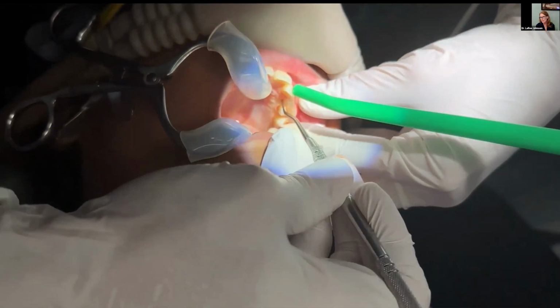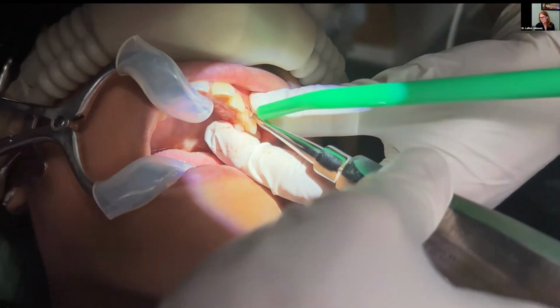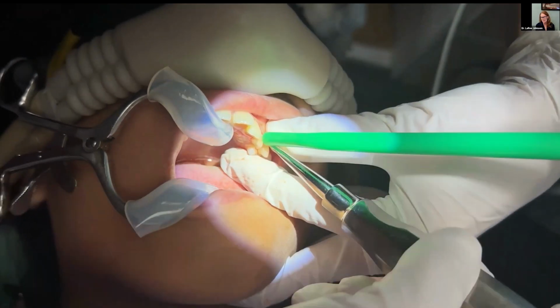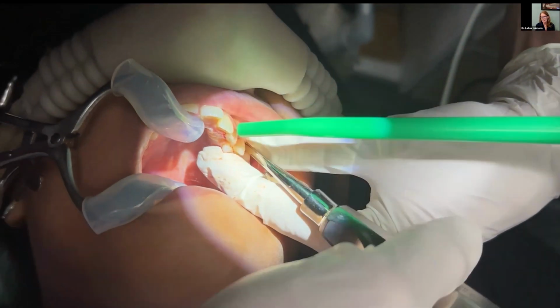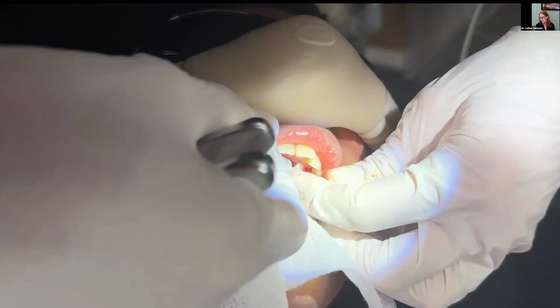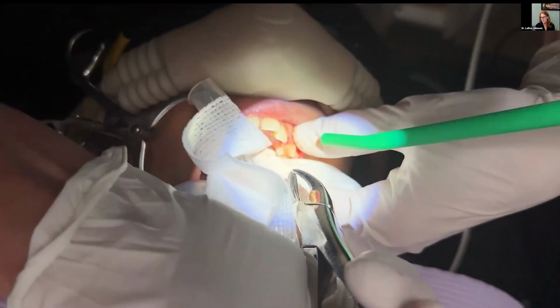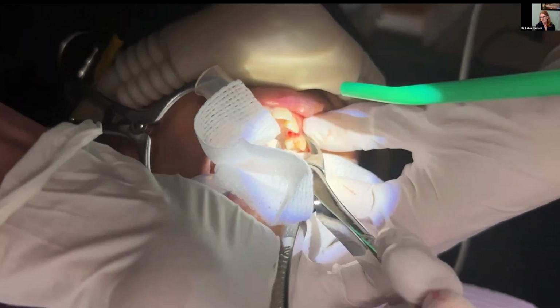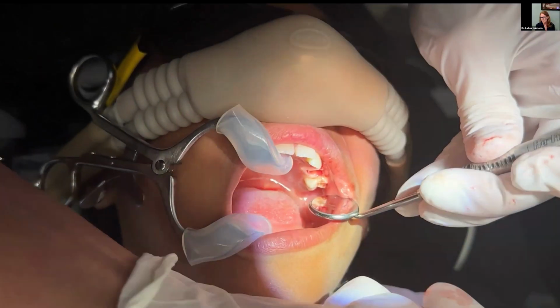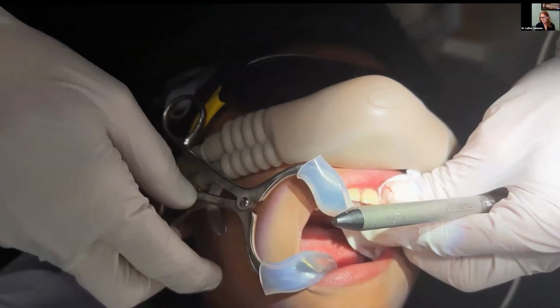I usually don't use elevators on primary teeth unless they're ankylosed, but I do on permanent teeth, especially 2-rooted maxillary premolars. Those little guys can be tricky little devils sometimes. Holding, of course, the cortical plate or the alveolus to make sure my expansion isn't overdoing it. I can feel the plate release as I am helping this canine or this premolar on its way. And there we go. We're going to just curette that out, take care of things, and call it good. And that's a permanent tooth.